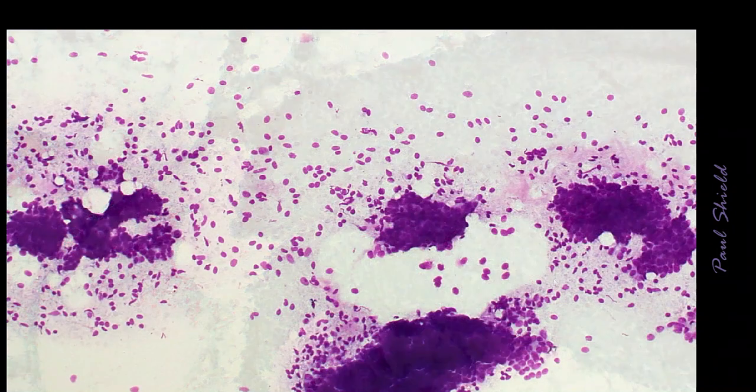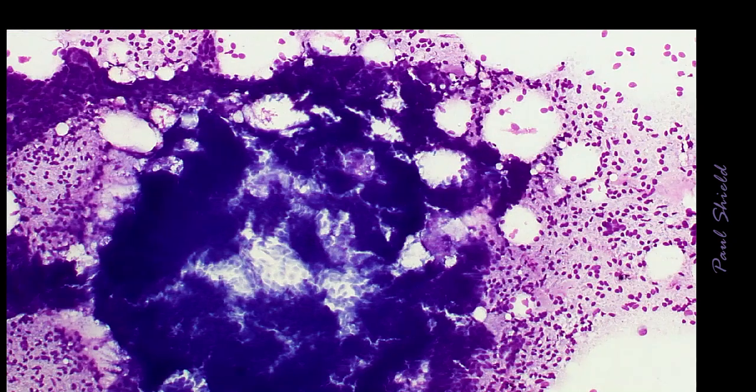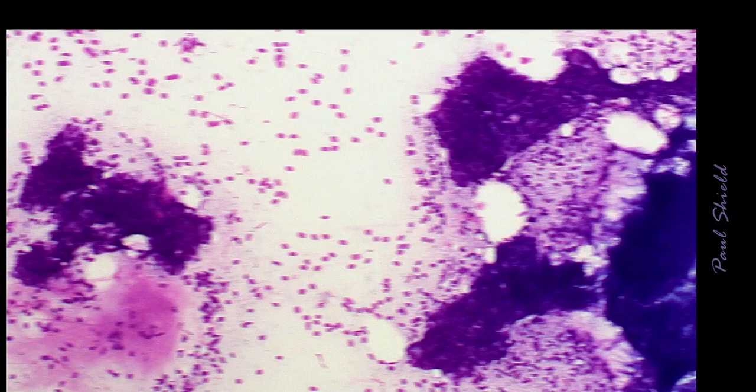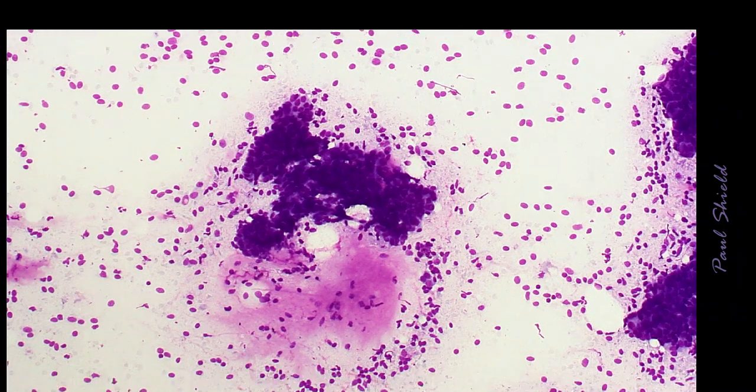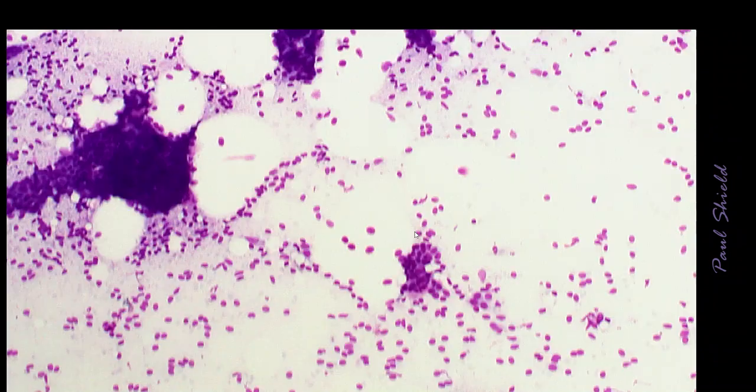Another huge group here of epithelium, and I think even at this power you can see that it's bimodal and cohesive. This is the Giemsa. Notice all the bare bipolar nuclei in the background here. Some people describe these as being like showers. This is some more stroma here, that pink mucinous looking material underneath the epithelial cells. Lots of bare bipolar nuclei.